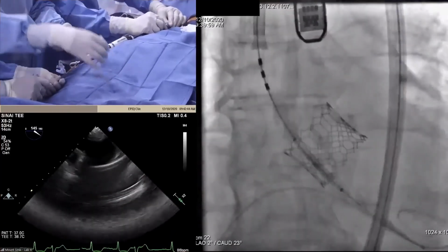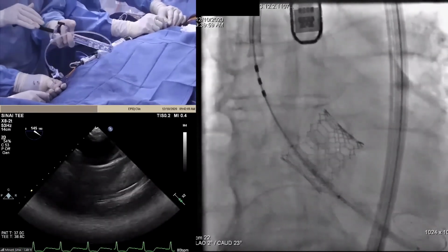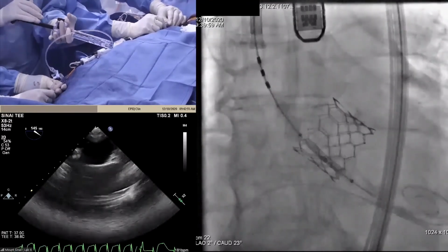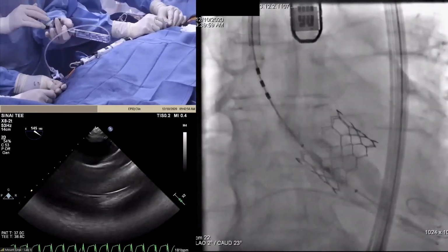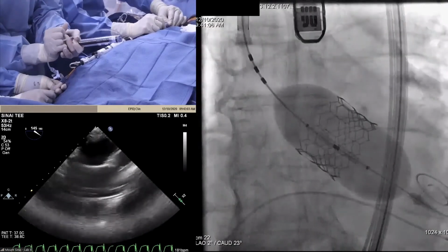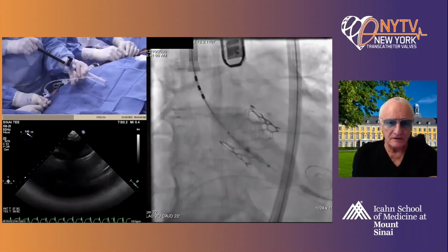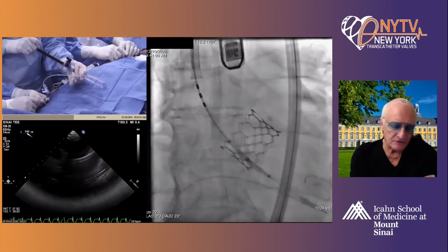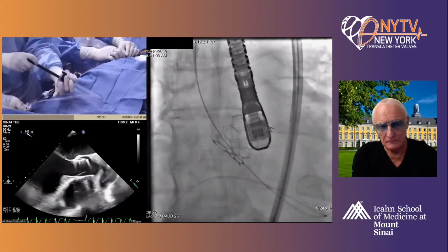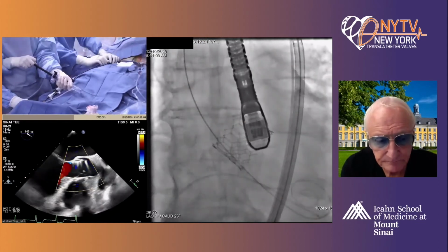All right. No, this is a really good point. So the supraannular configuration. Eric, we are post-dilating. As they're post-dilating, any comments, Eberhard, Alex? I think I would like to mirror Didier's point. I think this is what we see when you try to circularize in a large annulus. You know, there will be some leak, and I'm doubting that you get rid of it. Okay, stop. Okay, now we come out, right? It's still there.